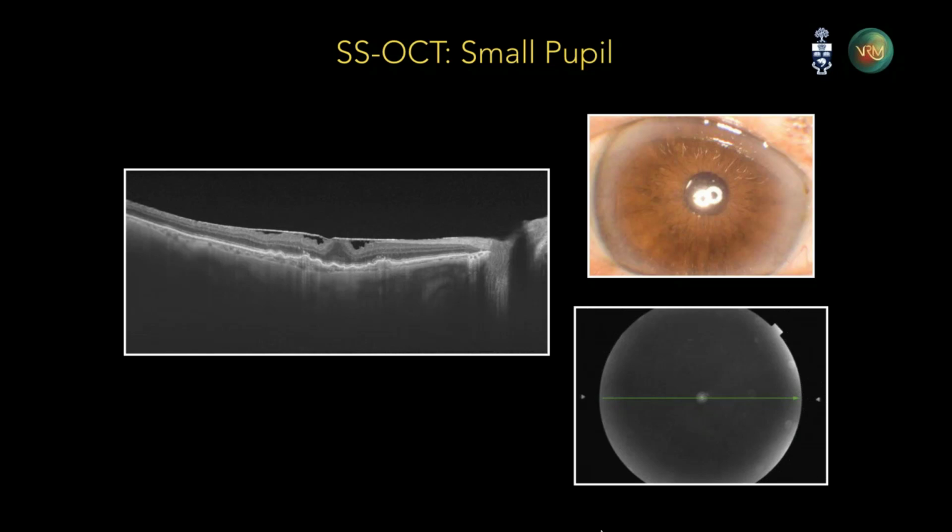Patients really remarked to us how much more comfortable the imaging was and how much faster their visit was. We've adopted this practice since about 2014, and we've been really successful in getting all the results that we need. Of course, there's always going to be one or two people every so often who do need to get dilated because they need that extra access. But for the most part, 99% of our patients do not need dilation for OCT.